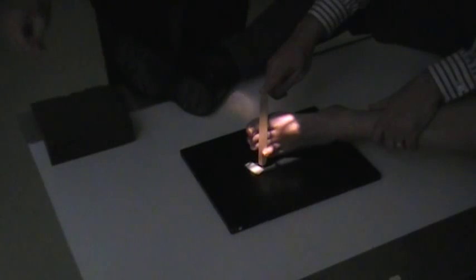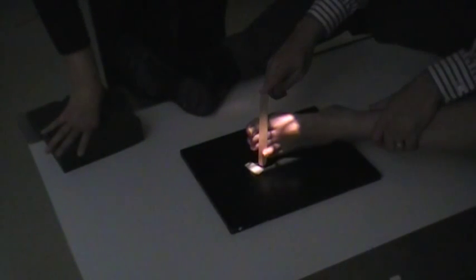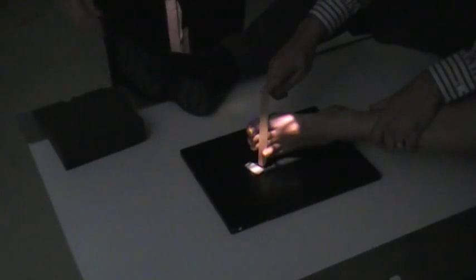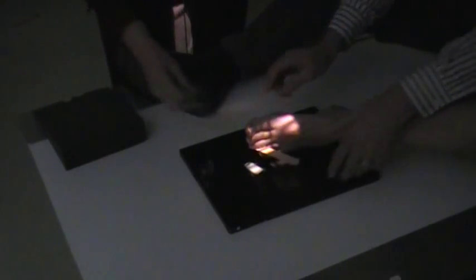So now we have imaging of just that one specific toe. You can do this for any of the toes.